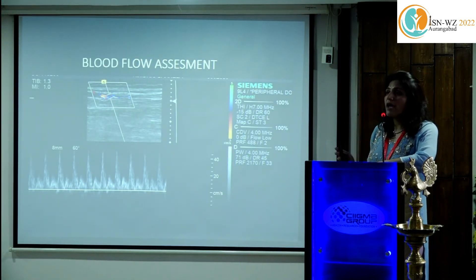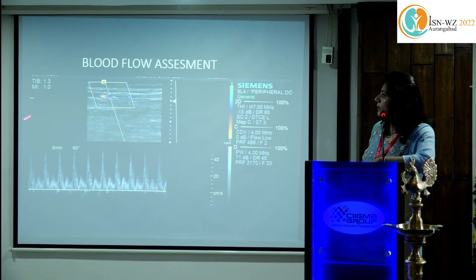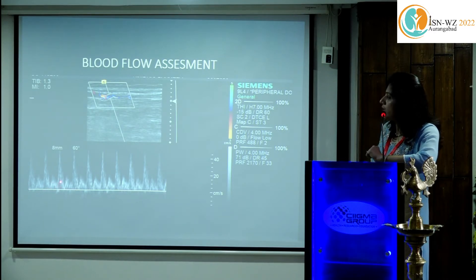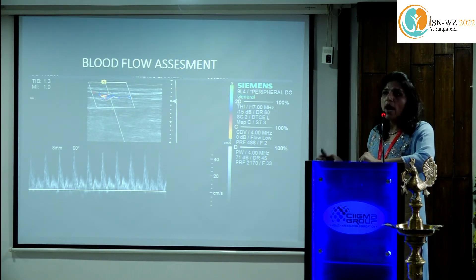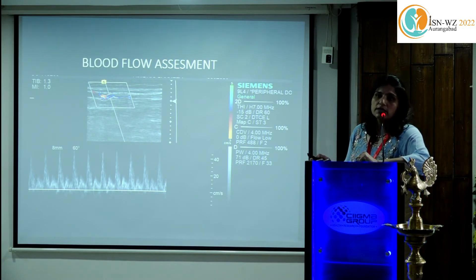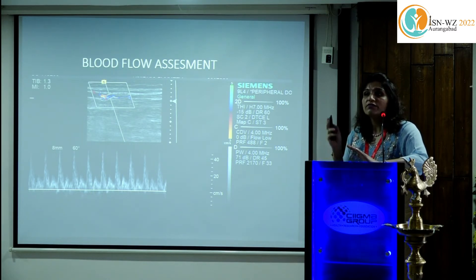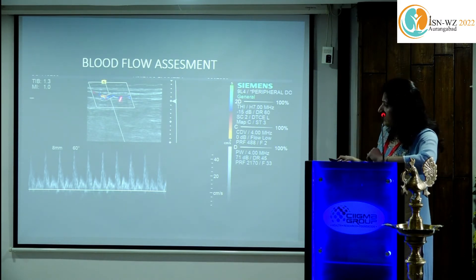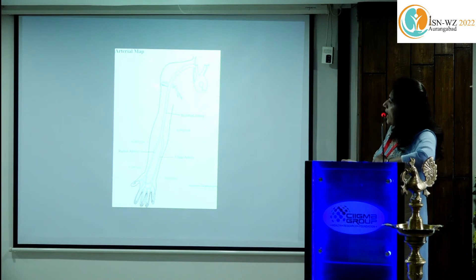Blood flow measurement: the typical triphasic flow is the hallmark for all upper and lower limb arteries, reflecting high resistance. You have a high peak systolic flow, a reversal in diastole, and an end-diastolic upstroke. This triphasic flow indicates normal arterial flow. We suggest a radial or brachial artery with a flow rate of more than 50 ml per minute, normal diameter, normal wall, and good triphasic flow for AV fistula construction.